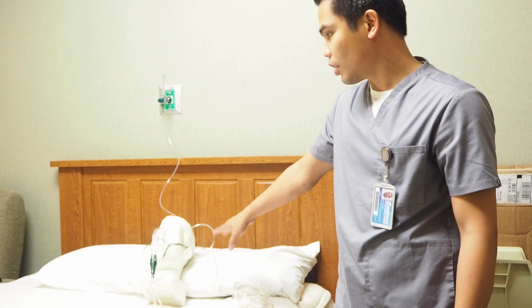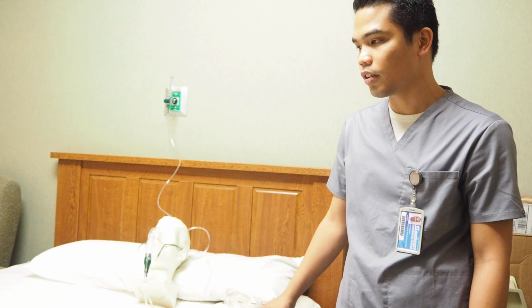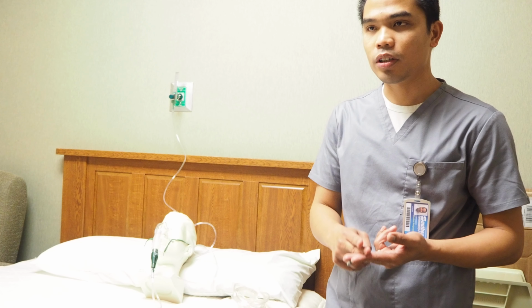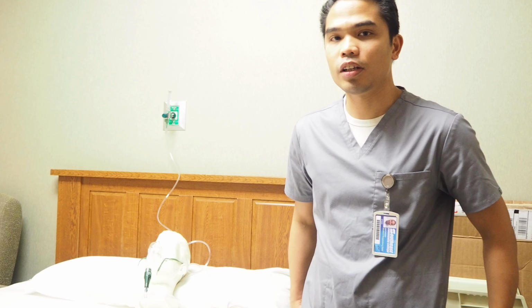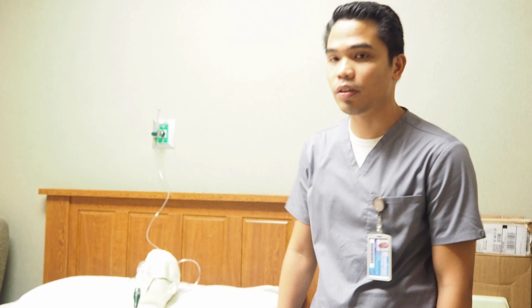Every time it's done, make sure we reassess the patient again, obtain vital signs, re-auscultate, and then once outside, we always chart everything that we changed with a new device, and communicate with the physician who ordered it and the nurse in charge, so that they know that we already changed to a new device.